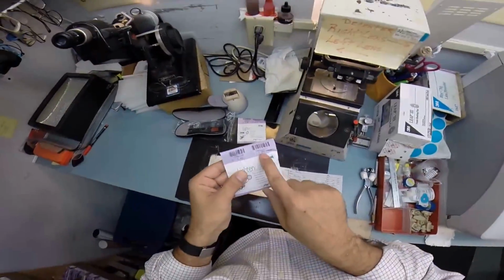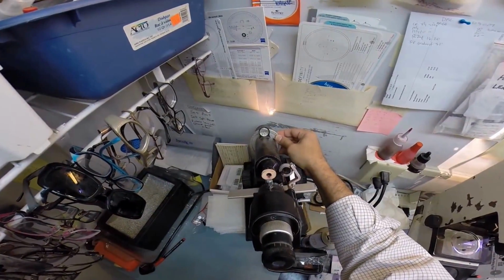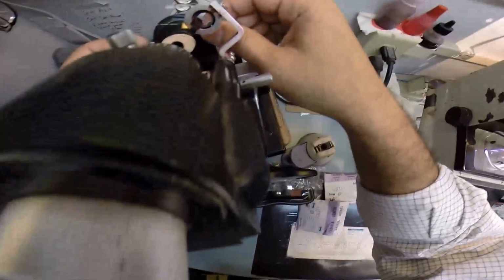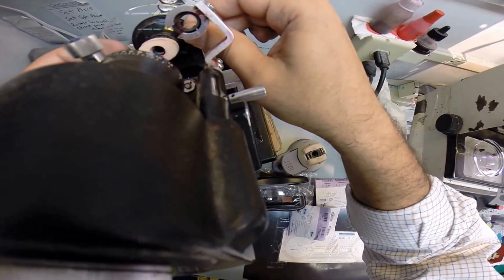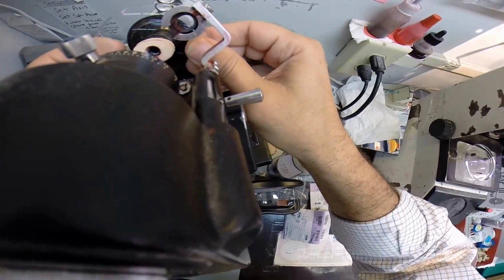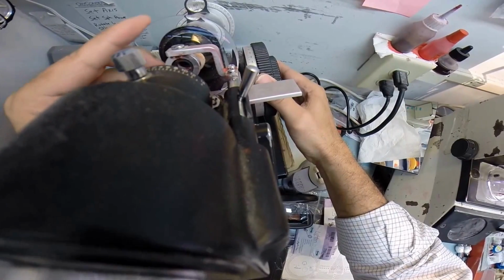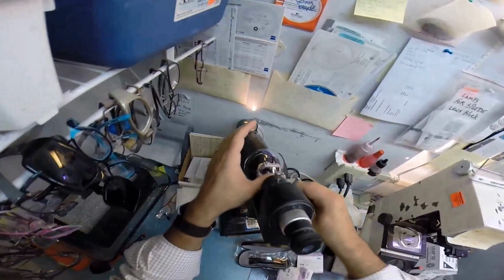Now your left lens, -3, -1/4 at 84. I'm going to spin the axis wheel to 84. Hopefully you can see the 84 in there. And again, this is on -3. I'm going to put your lens in, rotate it. Actually, I had it dead on, but I'm still going to rotate it again just to double check. That is good. I'm going to put the clamp down, hold it in place. Check your astigmatism correction. That looks good. Now 3 more dots on there, and I'll explain what all this means in a little bit.